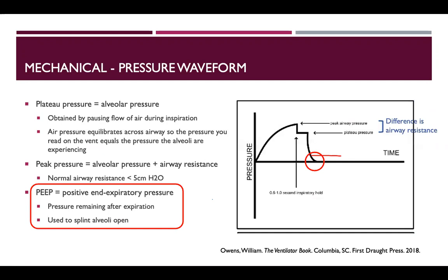Okay. So another thing that we talked about on the slide last session was PEEP, which you all know is the positive end expiratory pressure, the pressure that's still pushing back on the airway at the end of expiration. And instead of going down to 0, like this example has, we usually have patients on a PEEP of like 5 if they're ventilated, just to kind of ease up the discomfort of breathing through a tube. So usually after expiration, you'll see it kind of level off over here. And what can go wrong with this?